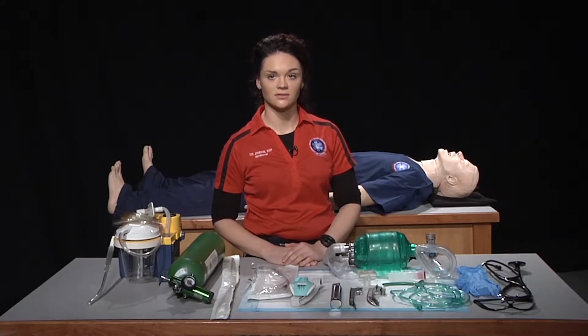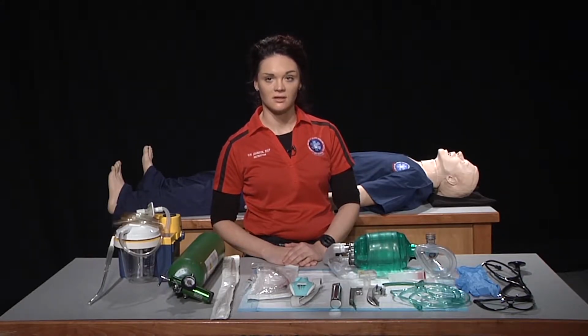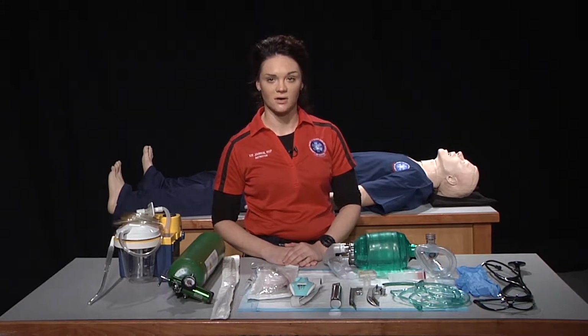This is the adult direct orotracheal intubation skill. The first thing we will do for this skill is gather our equipment.